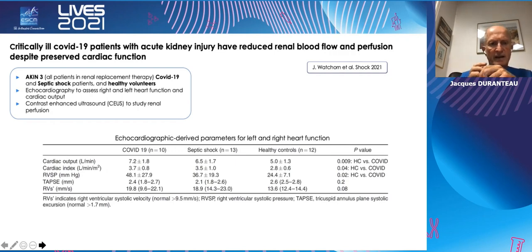You can see that they used contrast-enhanced ultrasonography, and in these patients, considering just macrovascular hemodynamics, there is no difference between COVID patients and septic shock patients, without any alteration of the left and right cardiac function.